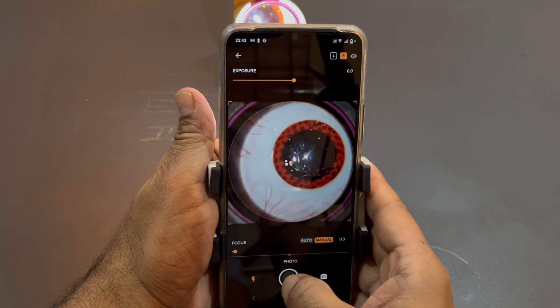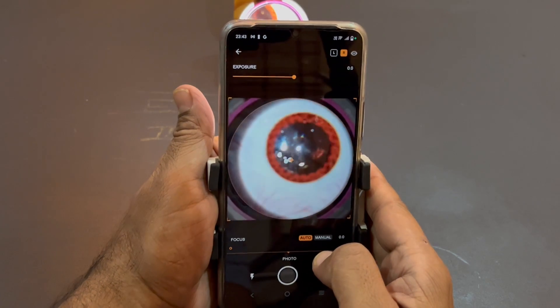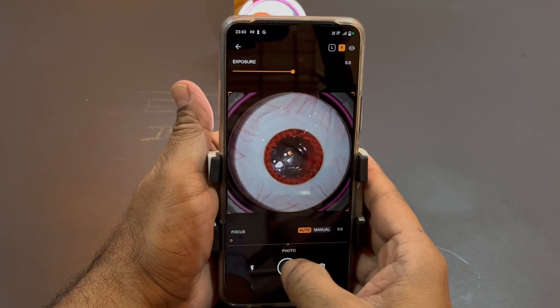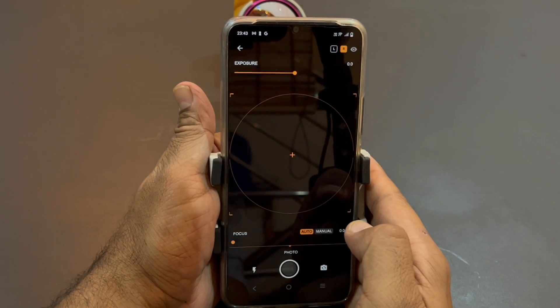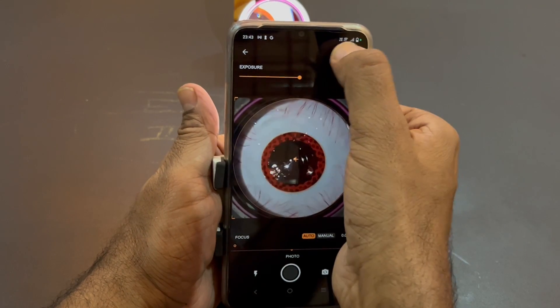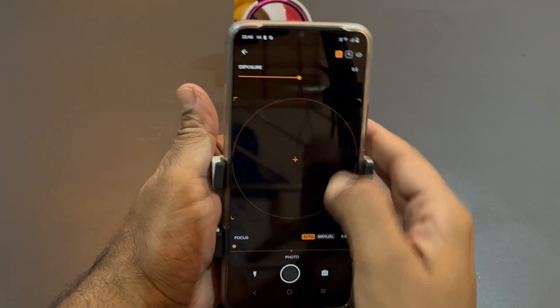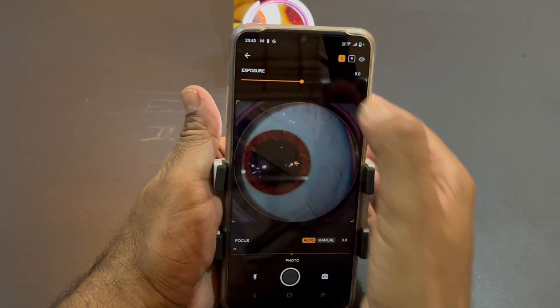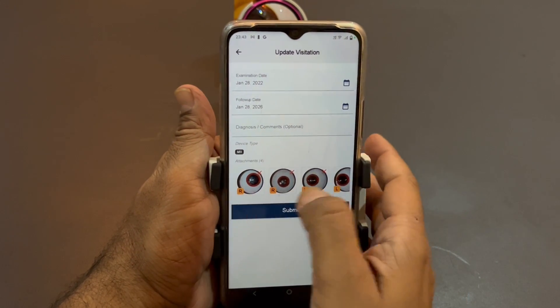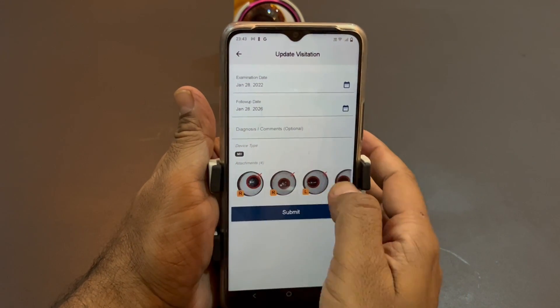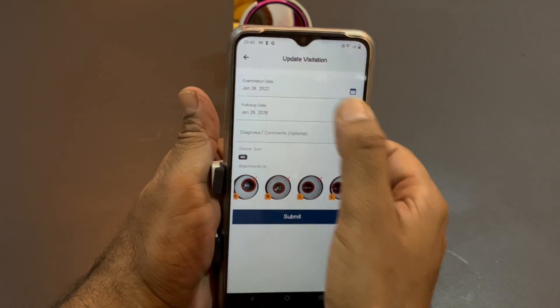Now, for example, we have clicked a picture. I am showing you how the application works — we have clicked two pictures. Let us take two more with the left eye selected. Once you go back, you can see all the pictures are already there labeled right, right, left, left.